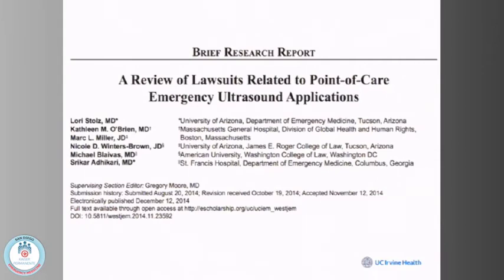lawsuits, and about, I'm going to do an ultrasound, I'm going to miss something, and cause a lawsuit. I've sort of been aware of some of the stuff that's out there, and Dr. Blivus is probably the person that gets consulted the most out of all of us in ultrasound to be an expert on cases and stuff like that. So he's like, most of the time these cases are not because the doctor used ultrasound and made a wrong diagnosis. In fact, he couldn't find any of those in the literature. The cases surround sometimes the failure to do an ultrasound, particularly when it comes to vascular access.